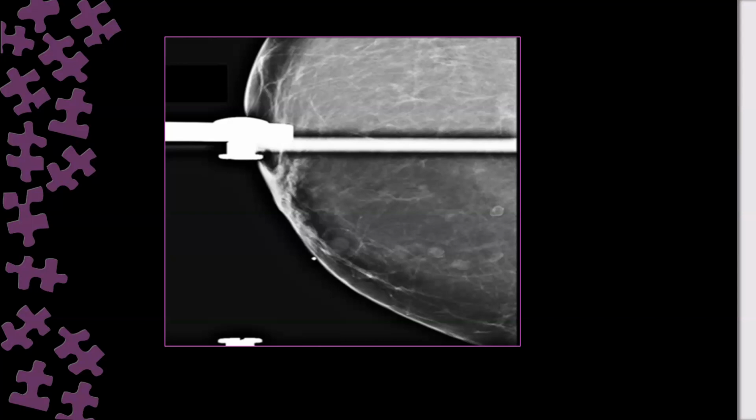So I could see the marker here along, as if I could see what? Can you see the marker end on, or do you see it on or in? In which direction do you see it?